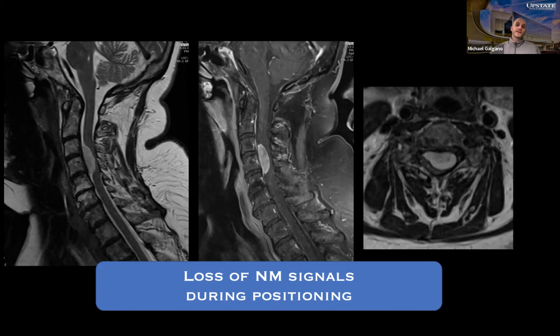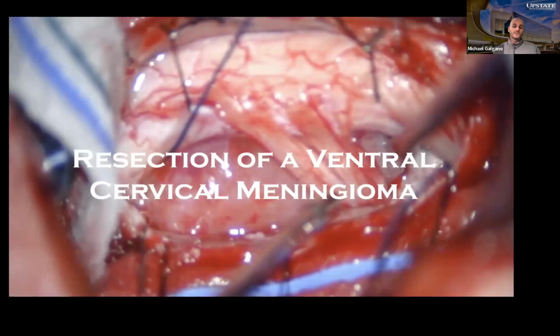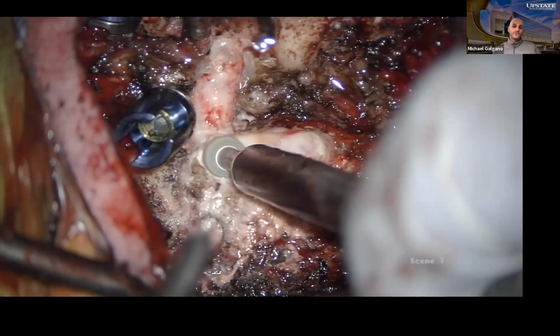So what we decided to do is we played with her head a little bit, and we kept her in not really the most ergonomically comfortable position to operate in, but you can't really appreciate it here either. We flexed it pretty significantly, believe it or not, and we started getting our signals back. At that point it wasn't back to baseline, but we thought we could safely take her. So here's a quick 90-second video, and I'll go into why I fused her after as well.